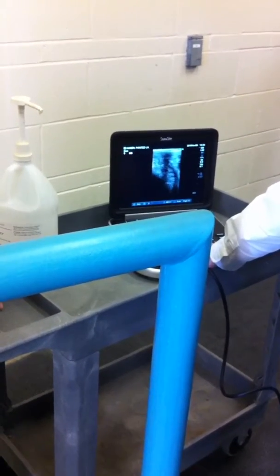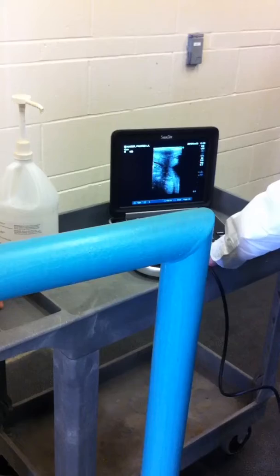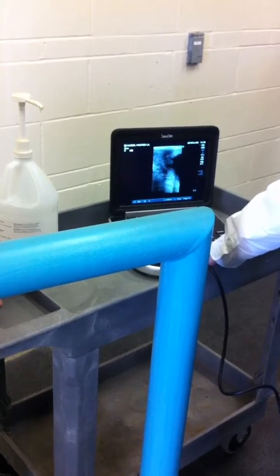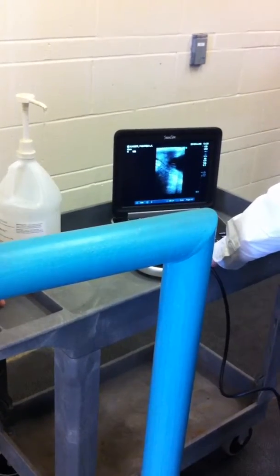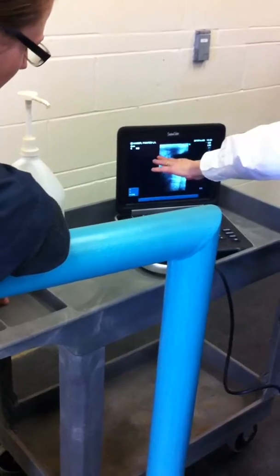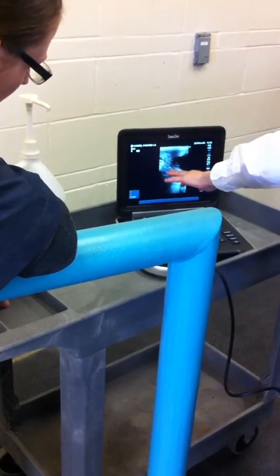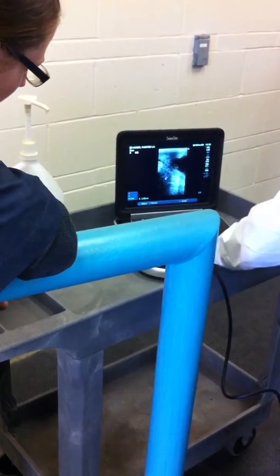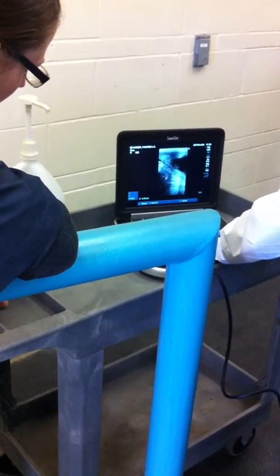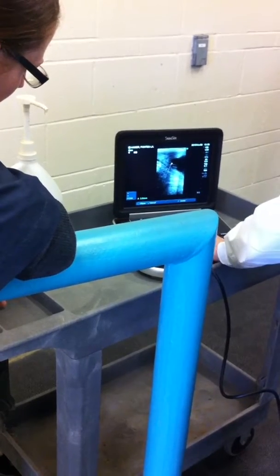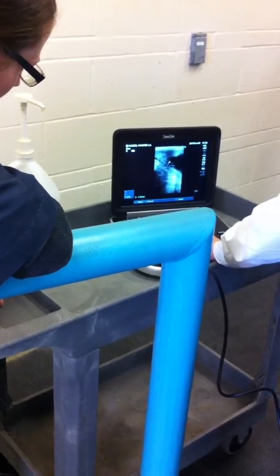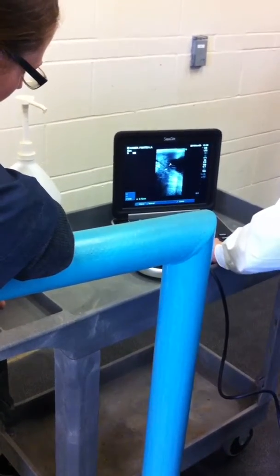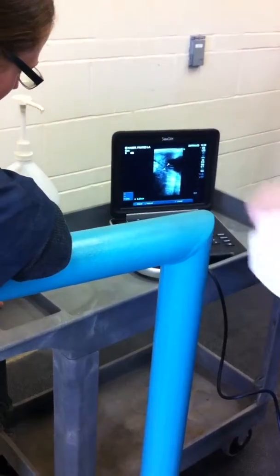That blood vessel should be a little crisper when I do it. So there's the cranial vaginal artery right there, and now I'm going to look at the line, and I guarantee you it is within normal limits. It is 0.6.